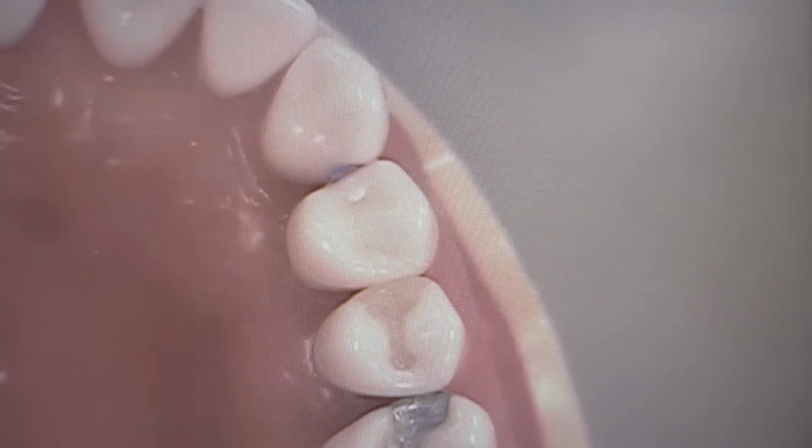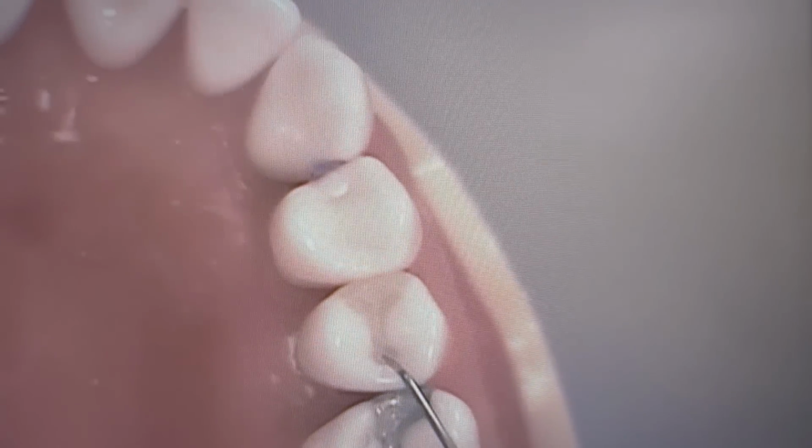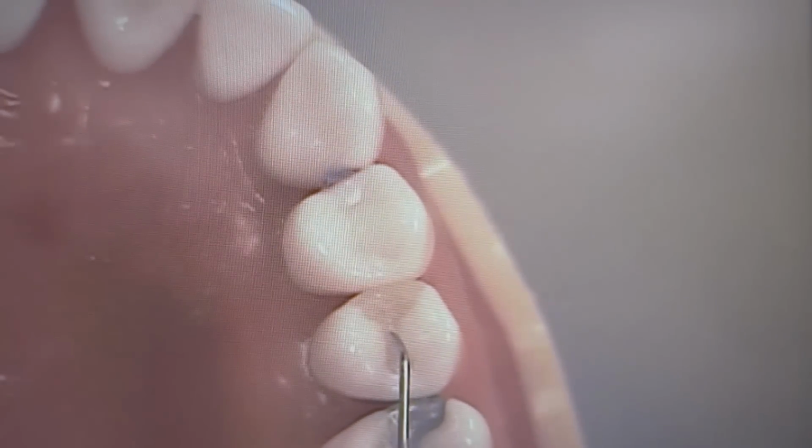Notice the evaluation, anatomy wise. Notice that the central groove is a little bit roughened. It's not the greatest, probably because I used my white stone. It's better to plane the anatomy, leave it alone, and remove all the edges, and you'll be fine. That's how you get the best anatomy. But right now it's relatively smooth.